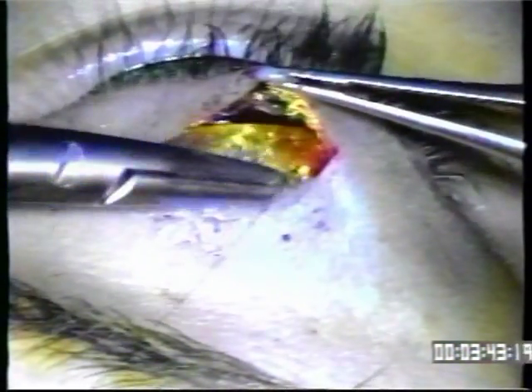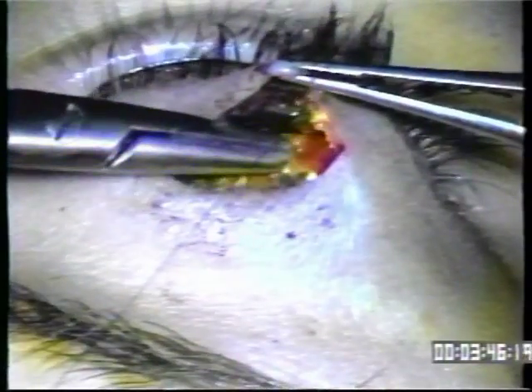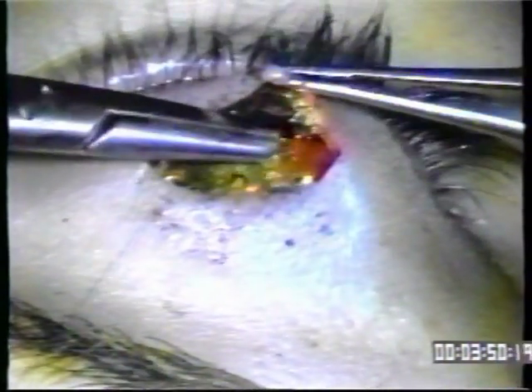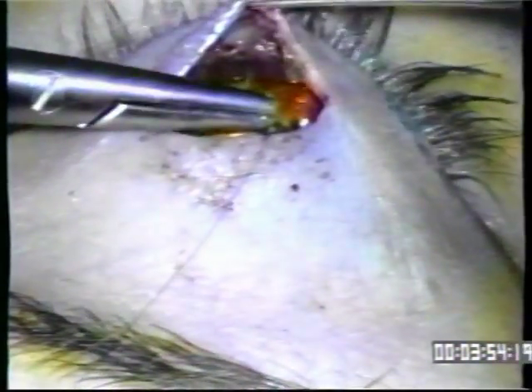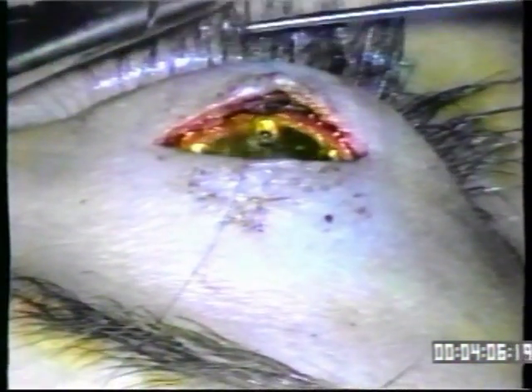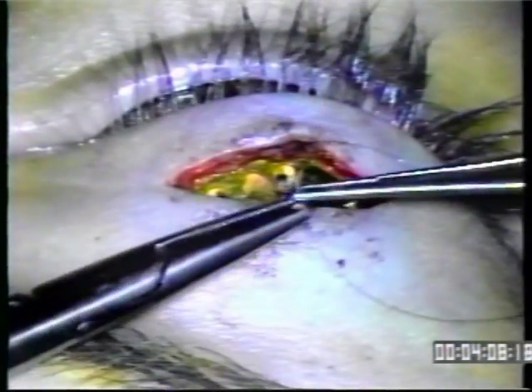Again, I want to emphasize: do not put the suture in the tarsal plate itself, because this will move when the patient opens and closes their eyes, and if you put it into the tarsus it will tear and come apart. One other thing to keep in mind — the tarsus contains glands, and if you tear into those glands you could result in infection.